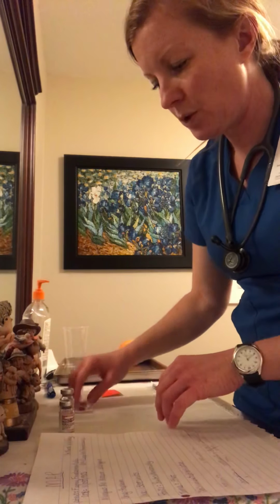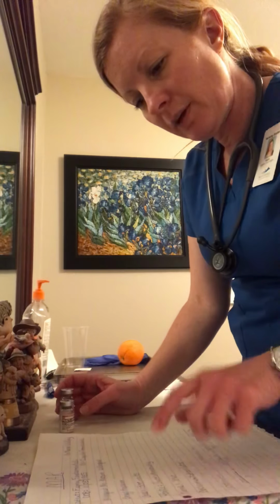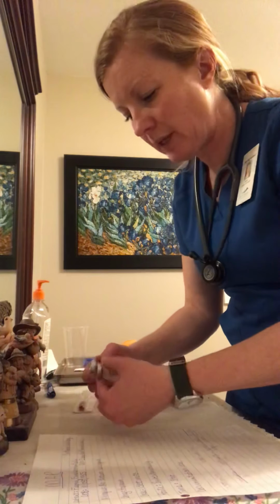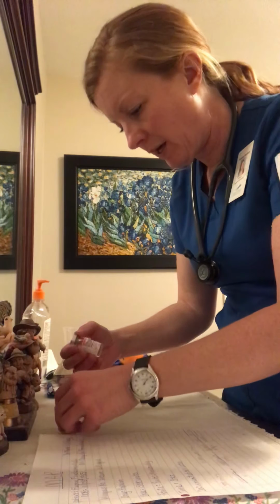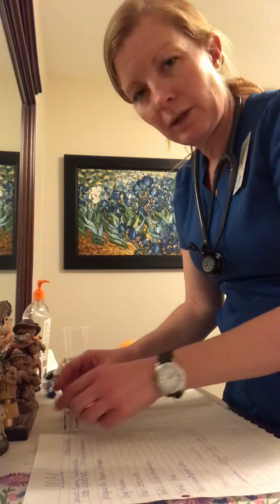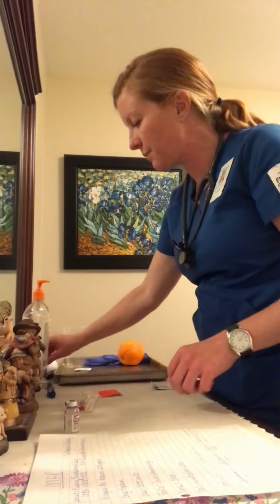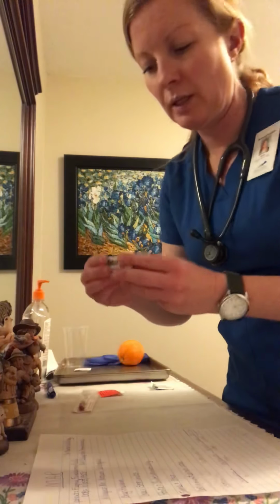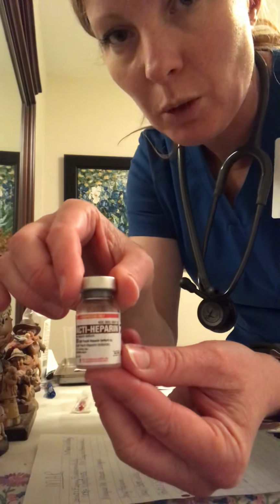And since there are two heparins, I'm going to say Fanny Fundamentals is getting heparin, 1,300 units. So I'm going to decide which heparin we're going to use. We have a 10,000 unit per milliliter, and we have a 1,000 unit per milliliter. For 1,300 units, we're going to be using the 10,000 units per milliliter. So I'm going to set the other one aside so that we do not get confused. So this is the heparin that I chose, the 10,000 units per milliliter.